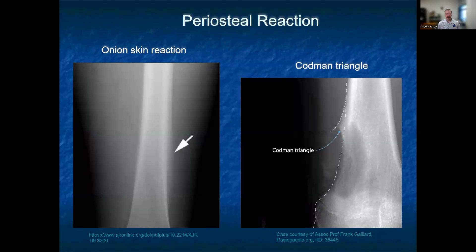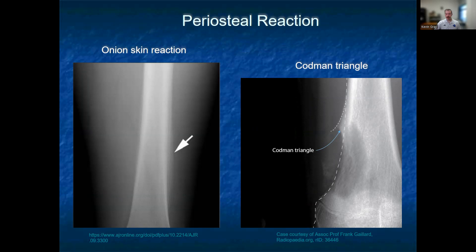Periosteal reaction can come in a couple of different forms, with a lamellated appearance as seen in this onion skin reaction, where new bone is being placed over top the existing periosteum, or a Codman triangle, where there is an elevation of the periosteum and a more acute angle.